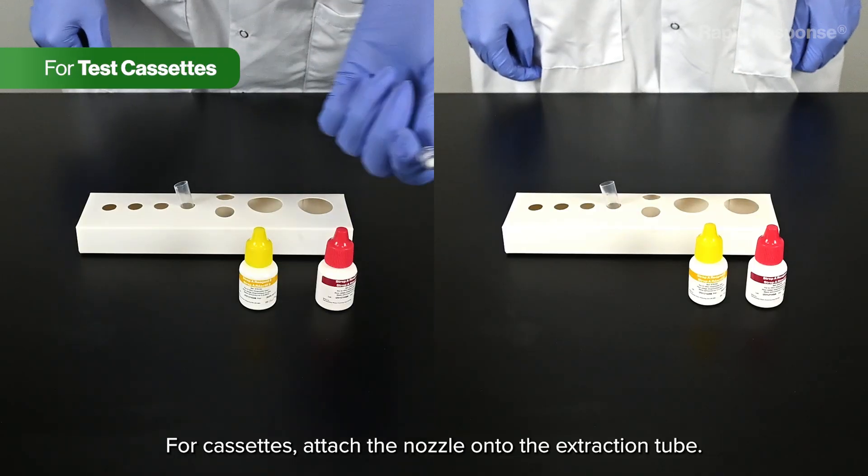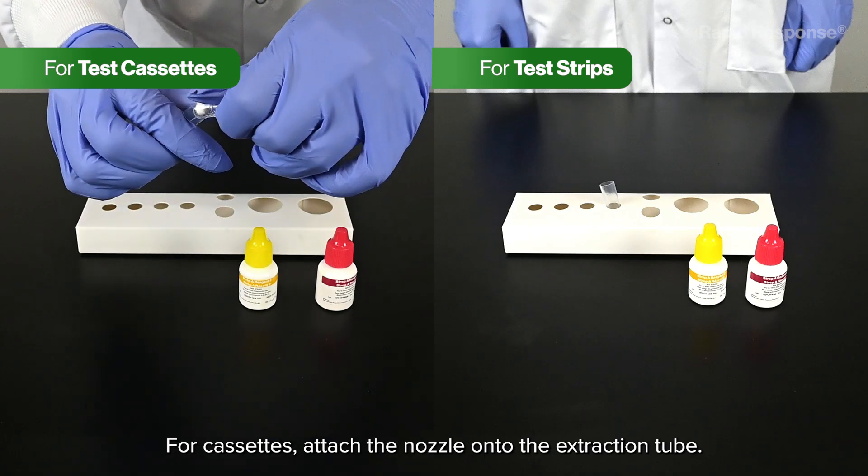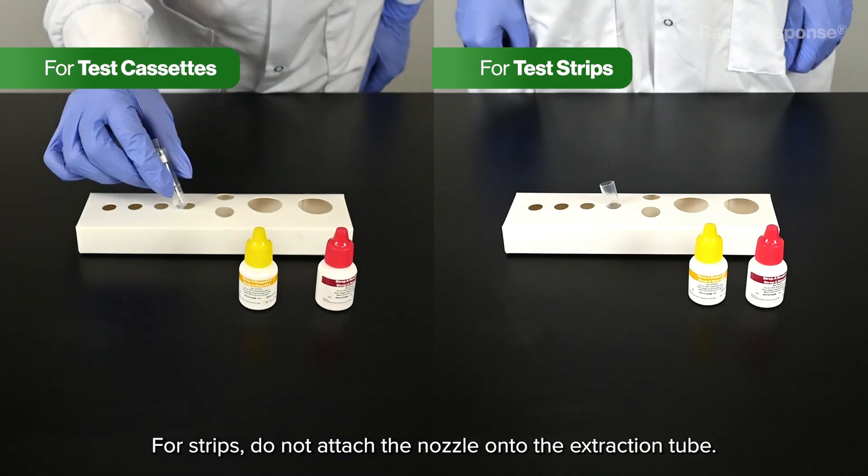For cassettes, attach the nozzle onto the extraction tube. For strips, do not attach the nozzle onto the extraction tube.